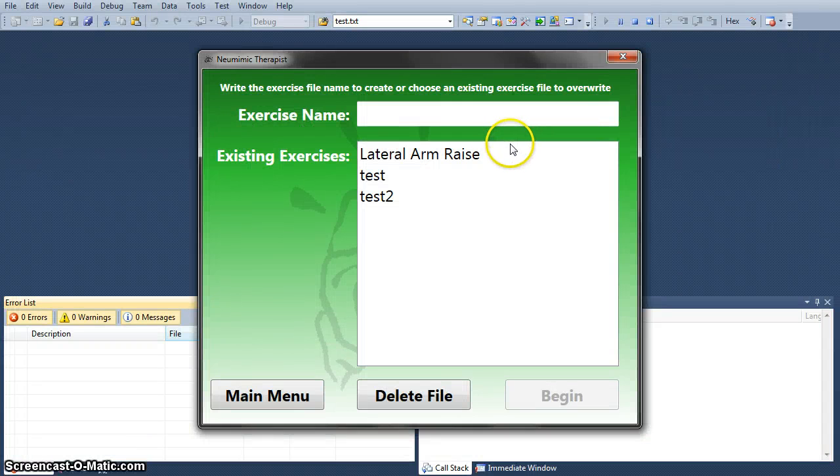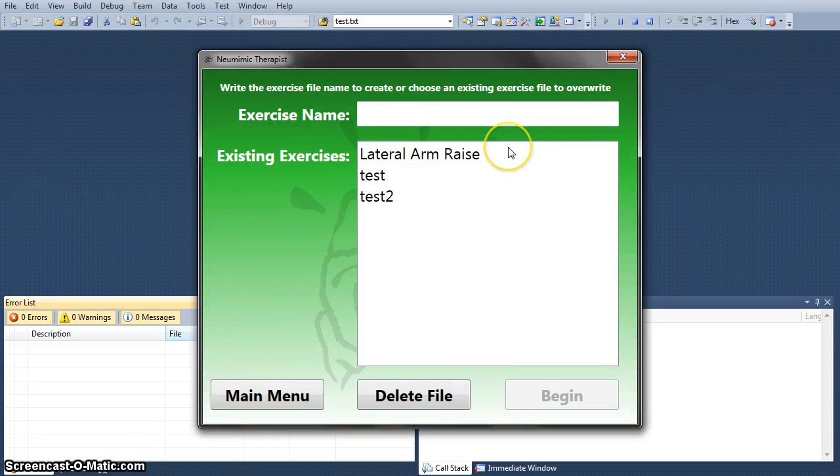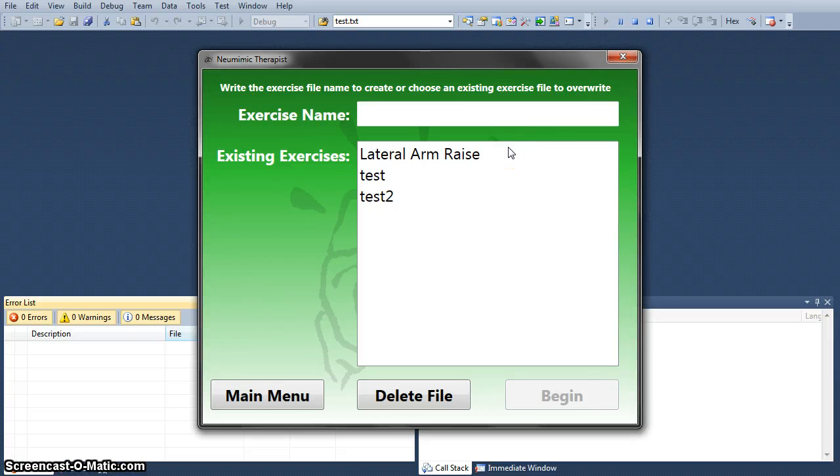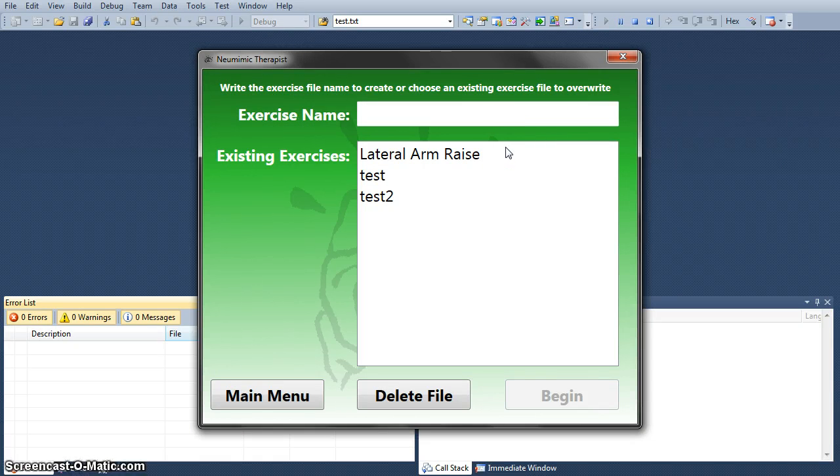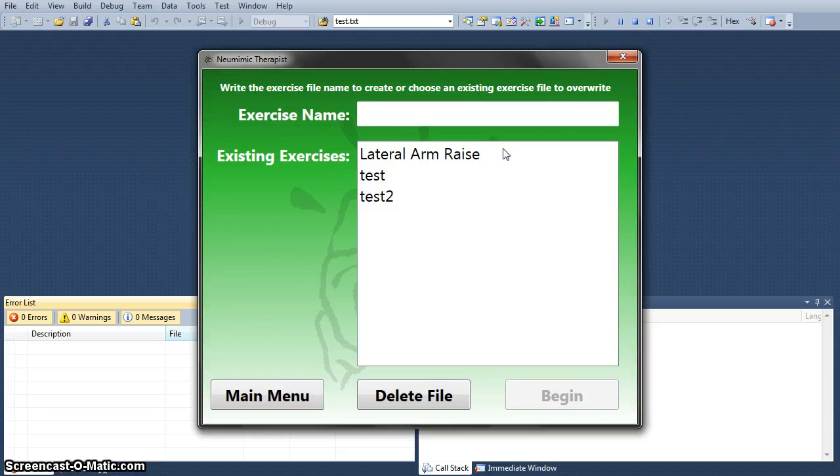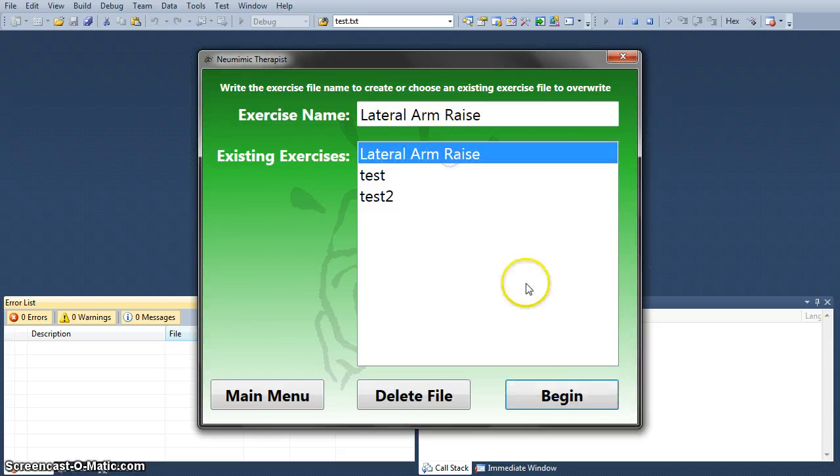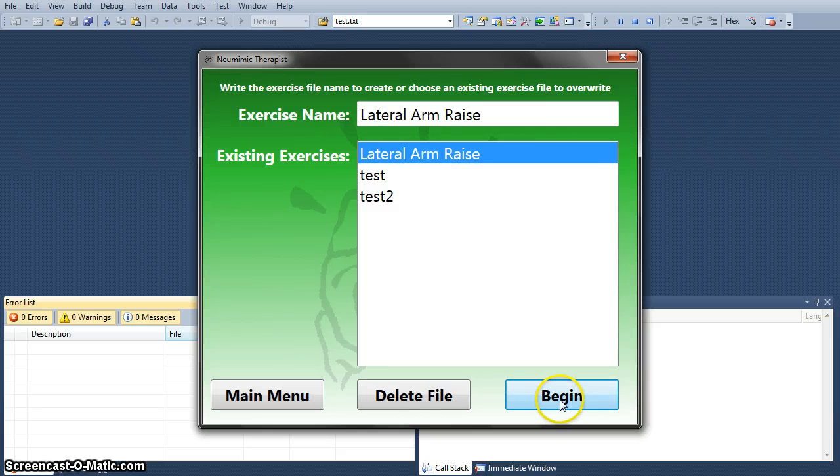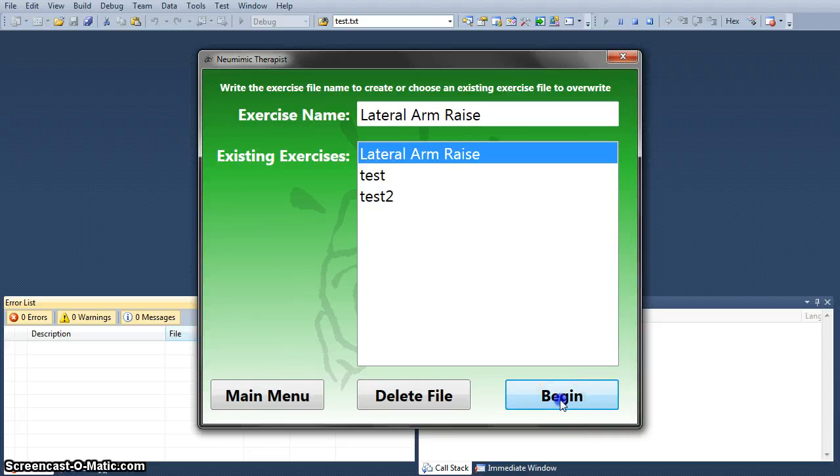The therapist will be able to stand behind me without actually being a part of the recorded motion since the Kinect will only be able to pick me up in the frame. We're going to do lateral arm raise for demonstration purposes, so let's begin.